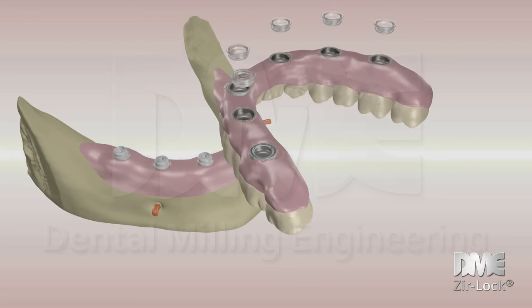It is recommended to use, in the first placement and for a week, the retainers of 1 kg called DME RTB, red color, later to be replaced, as seems appropriate to the doctor, with retainers of 2 kg, DME RTM, blue color, or 3 kg, DME RTD, glass color, depending on the number of implants of the patient and its location. Keep in mind that with a retainer of 3 kg, the patient will be unable to remove the prosthesis himself, while with the retainers of 1 kg, the patient will be able to remove the prosthesis and sanitize it by himself.